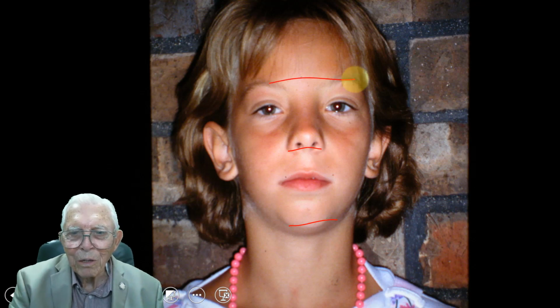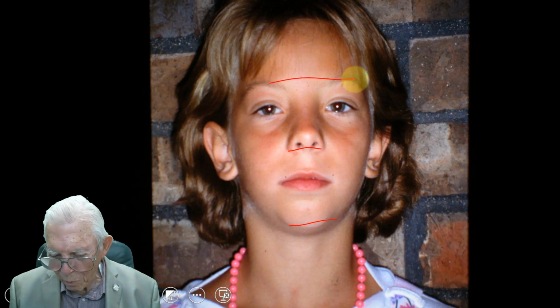You don't see it very well, but she has good facial structure, and the height of the face, the thirds and everything look good, and there's no problem in that area. So we didn't have to do the palatal separator that I did on the previous adenoid tissue problem. And there we're into the case already.